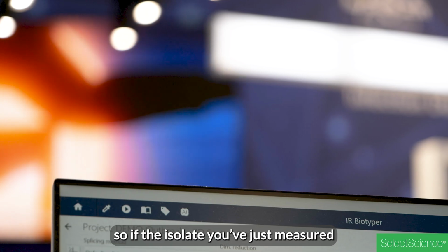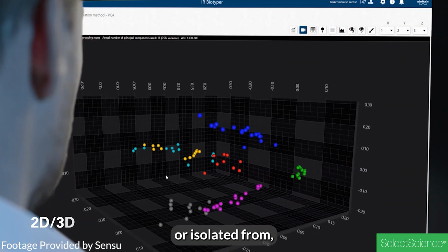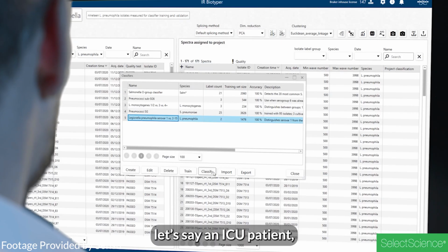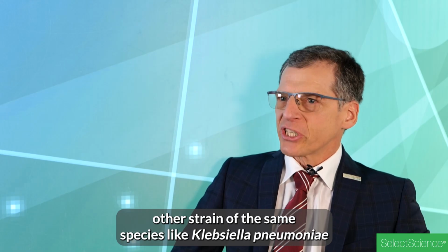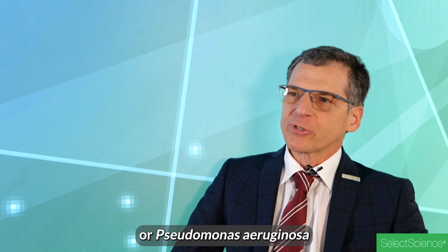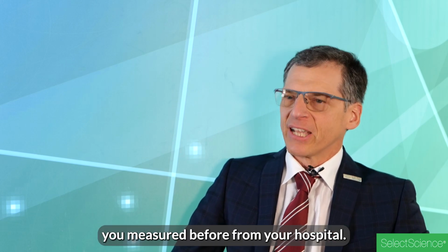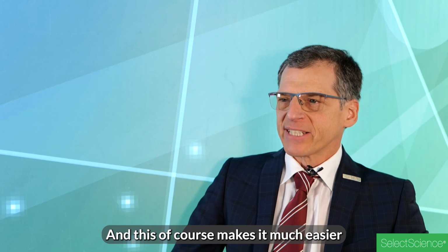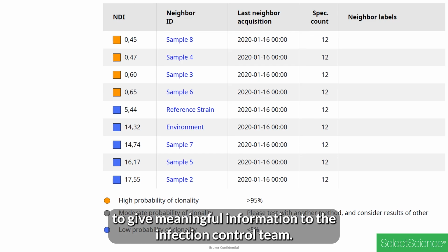So if the isolate you've just measured or isolated from, let's say, an ICU patient, is correlated to any other strain of the same species, like Klebsiella pneumoniae or Pseudomonas aeruginosa, you measured before from your hospital. And this, of course, makes it much easier to give meaningful information to the infection control team.